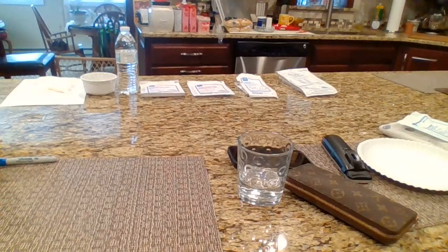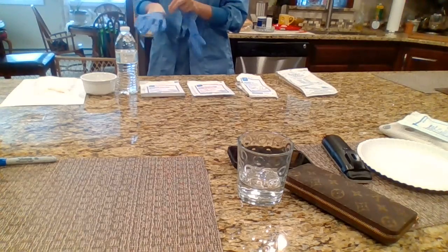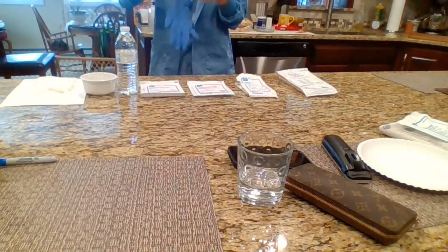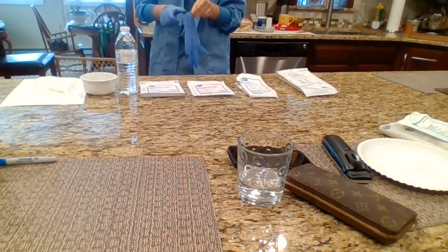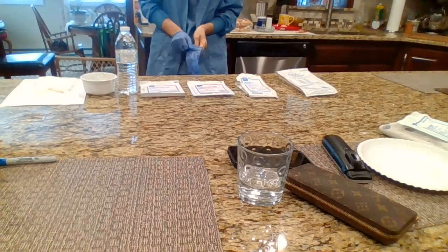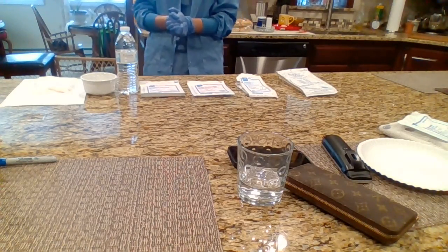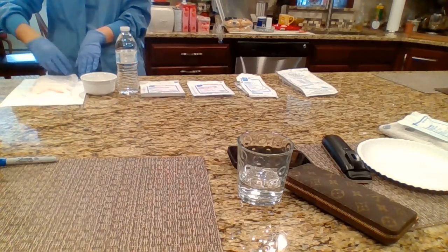Okay, next I'm going to apply a pair of just regular gloves. And then I would want to remove the old dressing. The way I do this is I peel up at all 4 edges first.